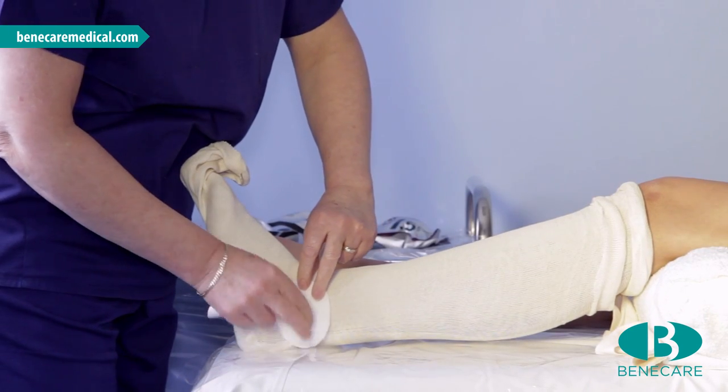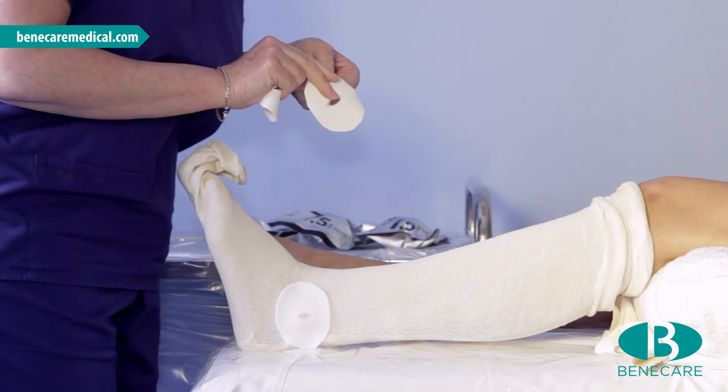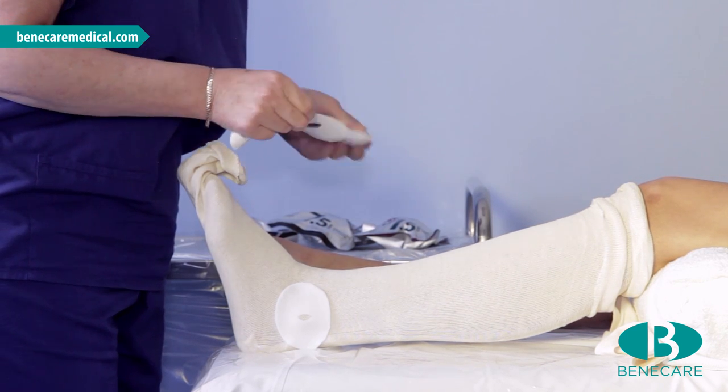Apply two pieces of adhesive felt that have been pre-cut to provide negative padding over the bony prominences.